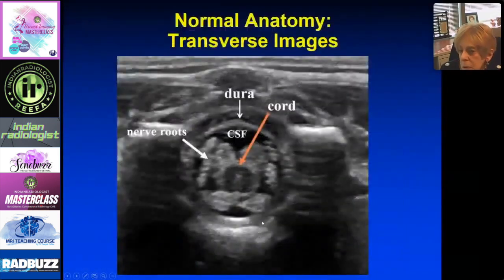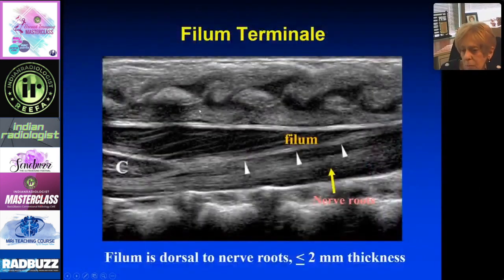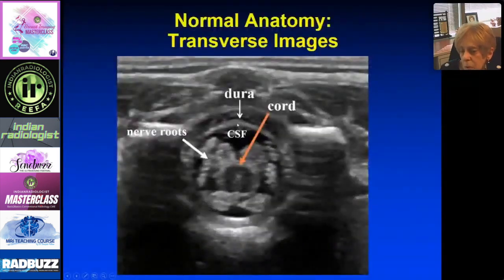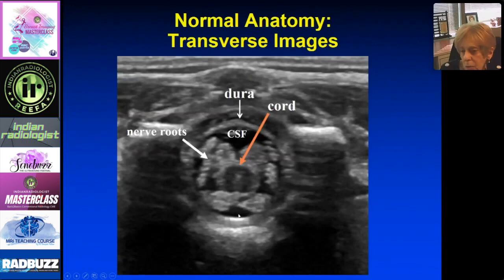On transverse imaging, it helps confirm an abnormality, though most of the pertinent anatomy is read from the long-axis view. In transverse, you can see the dura, the cerebrospinal fluid or subarachnoid fluid, the nerve roots, the cord, and more cerebrospinal fluid, identifying dorsal and ventral structures.